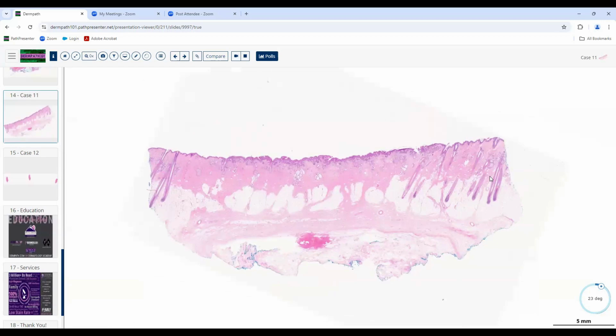And notice that there's hair here, and there's no hair centrally. So clinically, this would have appeared as an area of alopecia. So you see these patients come in, they've got this area where there's no hair, and you say, well, how come there's just a localized area of alopecia? Could it be something like alopecia areata? Could it be aplasia cutis congenita? Could it be some kind of neoplasm, if you will, that's causing it? It could be some sort of hamartoma.